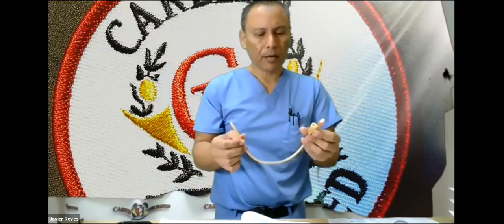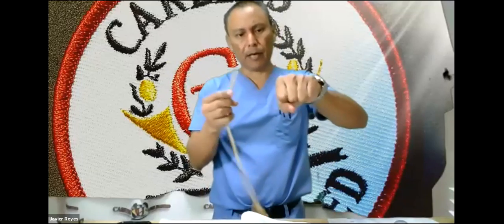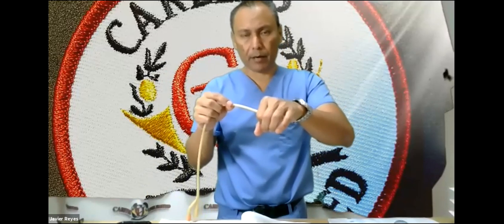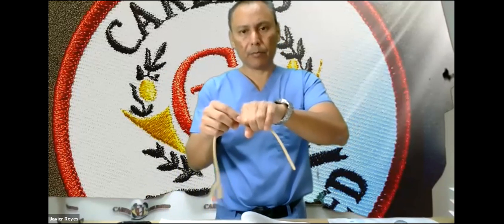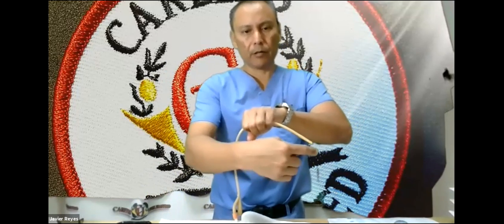Now, this is the part that's going to go into the bladder. So let's say this is the bladder. We insert it through, and if it's a male, we have to hold the penis. I'll go through the whole procedure in a bit, but it goes in through the meatus, which is the opening of the penis, or in the female, same thing, the meatus. It goes in here and then makes its way into the bladder. Over here, it's already in the bladder, and once it goes in there, urine automatically starts coming out.